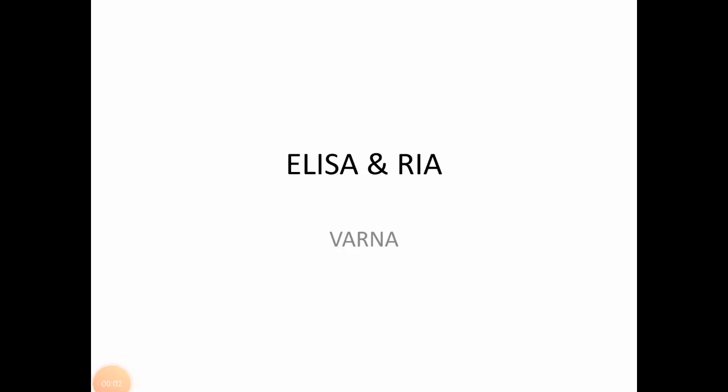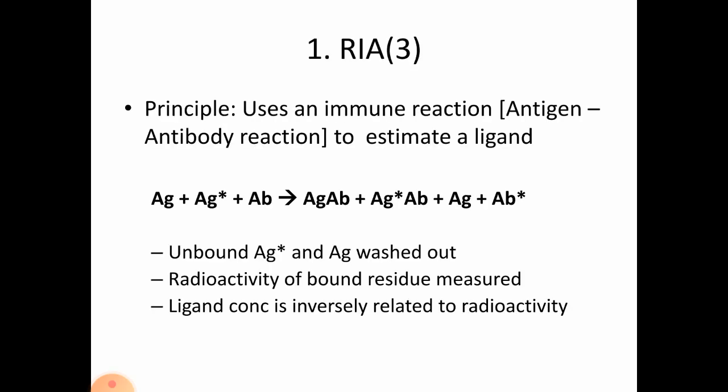Hello everyone. Now let's discuss a few techniques like ELISA and RIA. First question, RIA, radioimmunoassay, for 3 marks. You first give the definition of RIA. Next we can move on to the principle. You write about the principle, that is, it uses immune reactions, antigen-antibody reactions, to estimate the ligand.